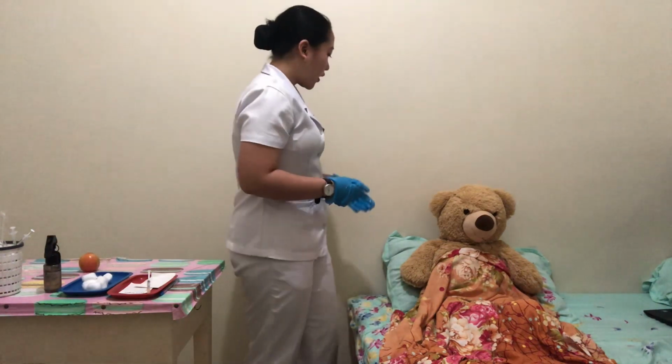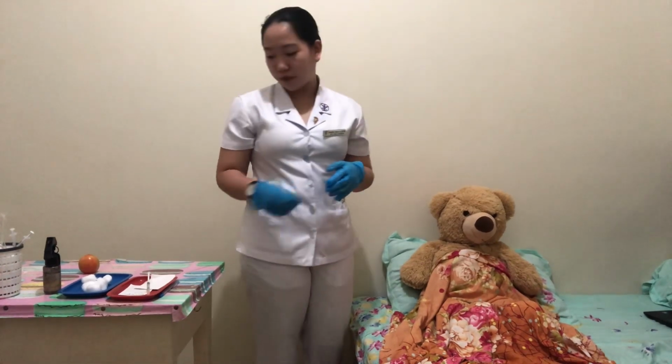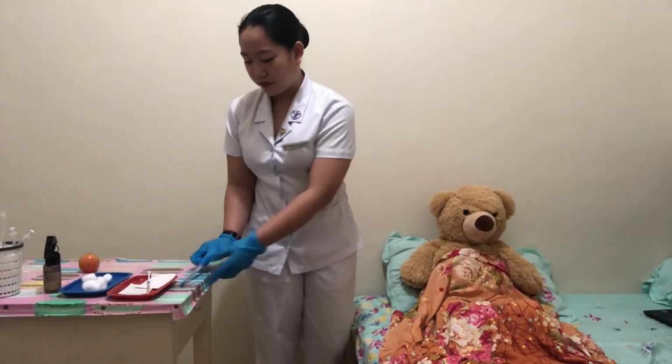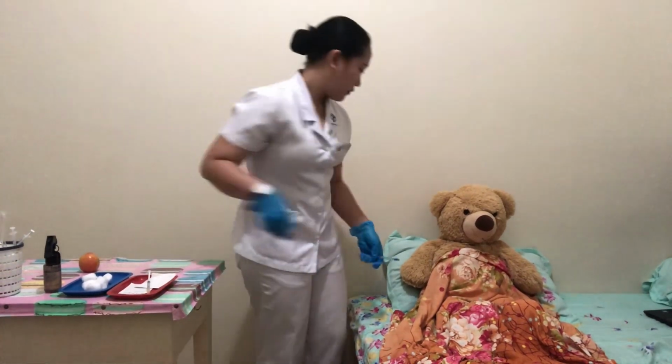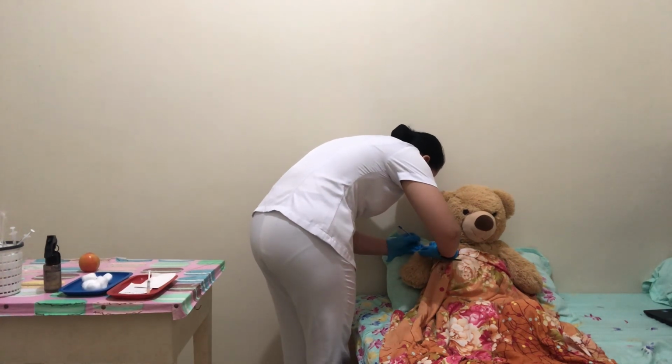So for the deltoid injection, the first landmark is the acromion process. So this is found high up where the shoulder is, and it comes out like a bony prominence. And then go about 2 fingers width down from that area. So here.